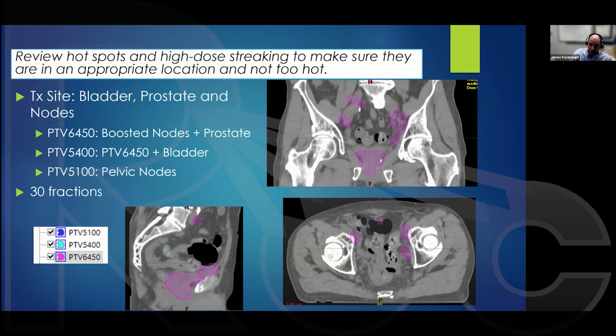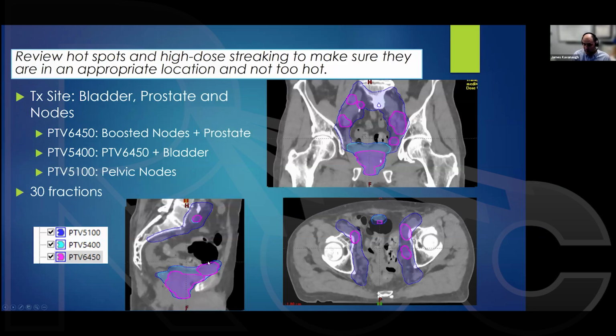This is atypical anatomy. As soon as you get into atypical target anatomy, now you're in the realm of something weird can happen, because if we apply the same optimization rules, we may not get the desired dose distribution. So I spend a lot more time looking at these types of plans. Just to step through, that is our high dose target. Here you can see the mid dose target going to 54, where it's now extending into where the bladder could be. And then there's the low dose target, including the nodal chain. So all of these together, and it's SIB. So this is super fun. I love these types of plans. They're very challenging, but this is where it really is important to apply our skills.